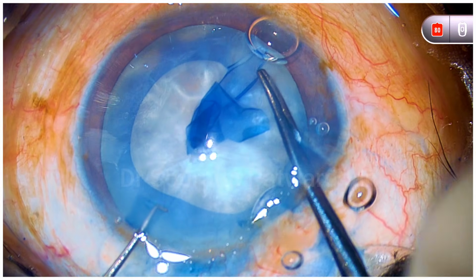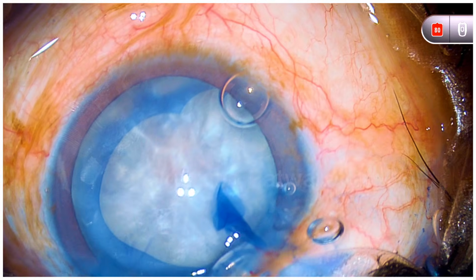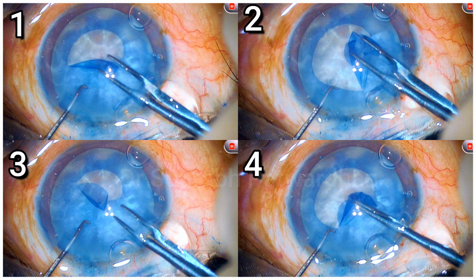Now, what we see, the end result is the extended rhexis, but where it started is also important. You can see this angle at which it started extending. So now let's go into these shots. These are four snapshots I have taken at different steps where the capsulorhexis is pulled, and I've named it 1, 2, 3, 4.